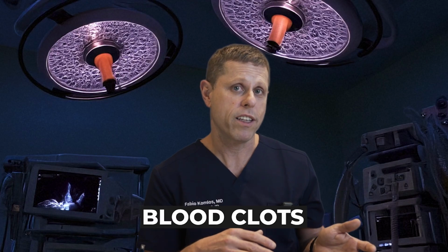In summary, an IVC filter is a safe and effective way to protect against life-threatening blood clots when other treatments may not be enough. As always, if you have questions, feel free to reach out.